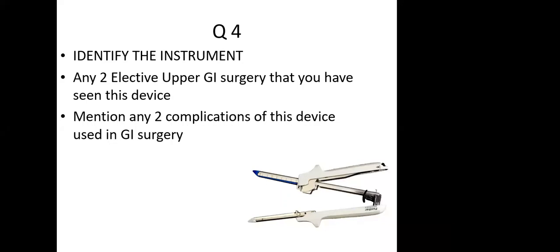Okay, and this is a very important advice. Please remember that throughout. Whenever you fire an open or a lap stapler, be sure to see what you are firing, because there is a parallax error and many times we have had injuries. The last will be delayed complications, where remember that stapler lines, like an anastomotic line, can sometimes lead to stricture.